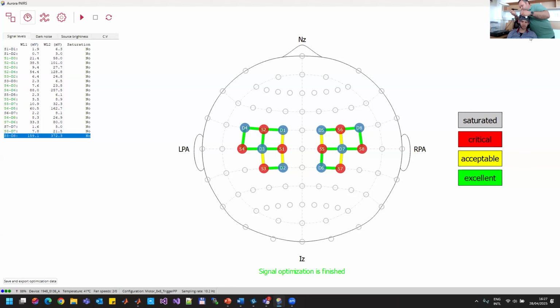Usually, coming back to fNIRS, to setting up the electrodes, the curly hair is the biggest problem. But as I said, using a spring number 3 and removing the hair first, it will work properly. Also, my colleague Alex has a lot of hair because I already emptied my syringe of gel. So he'll be very happy after this presentation.